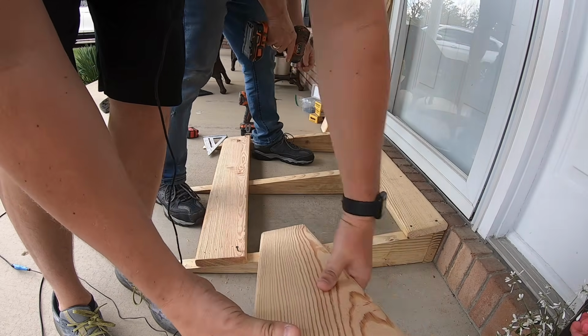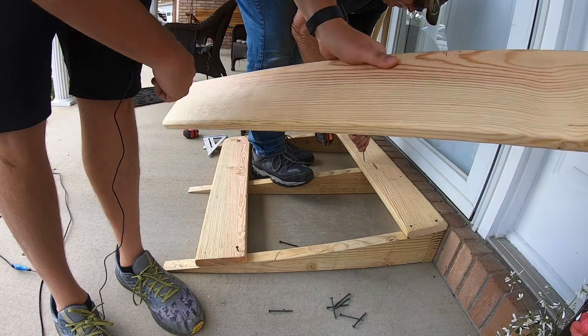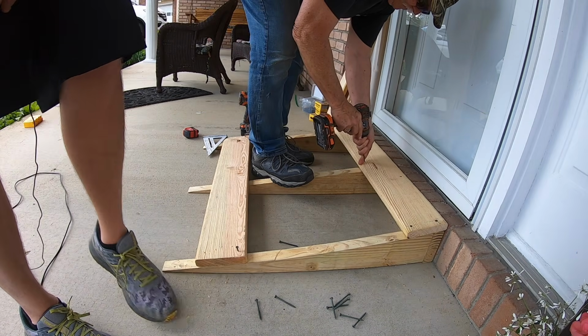Remember, pre-drill. Go ahead and run them in, or at least the 2 ends you want pre-drilled. You don't always have to do the middle ones.